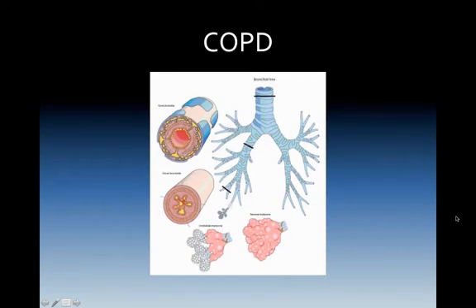In COPD, understand that no matter if it is increased mucoid production or trapping of air from emphysema, we still can have bronchospasm events. From the perspective of the end-tidal CO2, the waveform will still look like a shark fin.